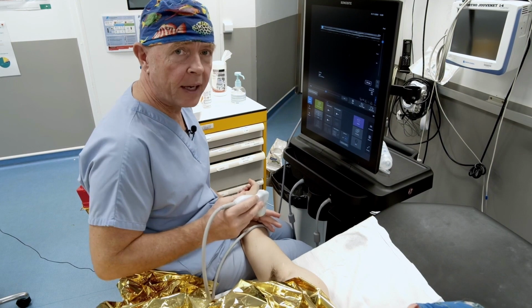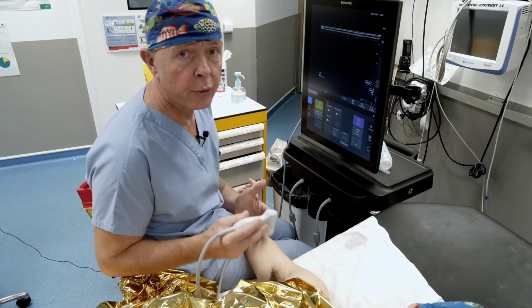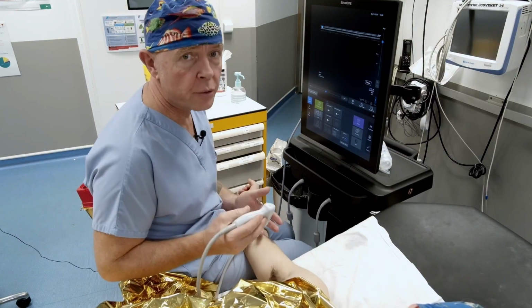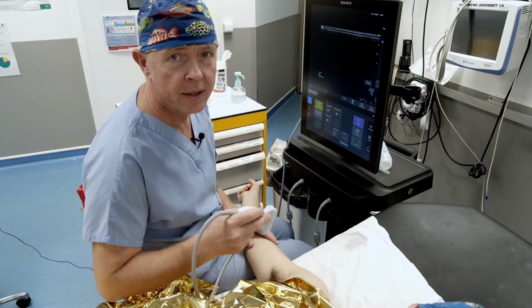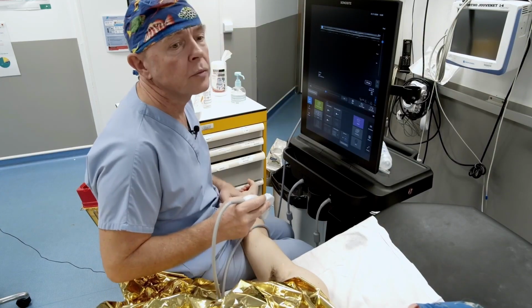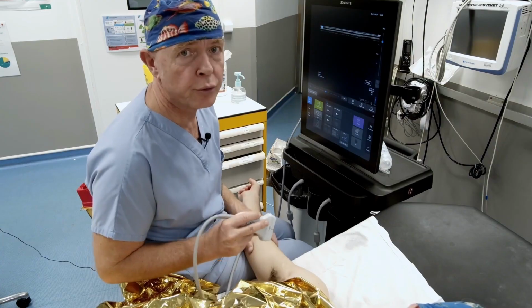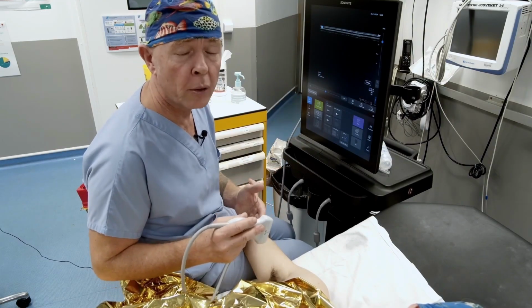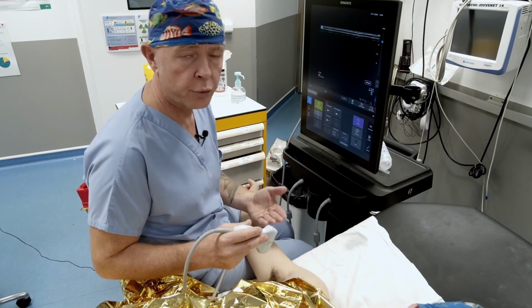Practical workshop number 4 therefore consists of aligning what we saw in workshop number 1, that is the elements of sonoanatomy, nerve recognition, including the structures and their dynamic characteristics, with ultrasound imaging and step number 3, the choice of the puncture site and visualization of the needle. So here, of course, this is workshop number 4. We will review the different limbs, the various blocks of the upper limb, the lower limb, and then the diffusion blocks.